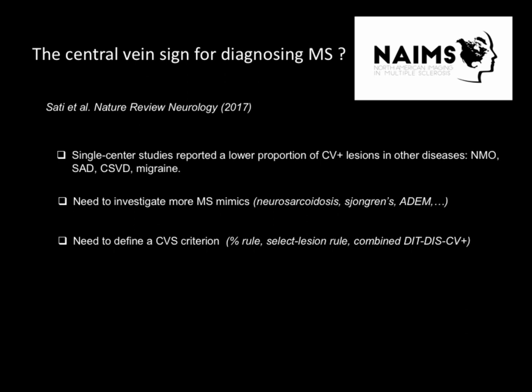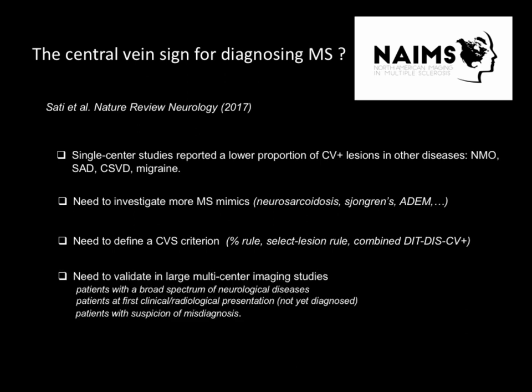central vein? So there is clearly a need to address this question, and therefore, having a consortium approach to it, using the power of multi-center studies, becomes critical here. And this is what we've been proposing in the consensus statement, to try to build up a cohort through a multi-center approach, where we image the patient using similar protocols, but we try to look at as many different diseases as possible.